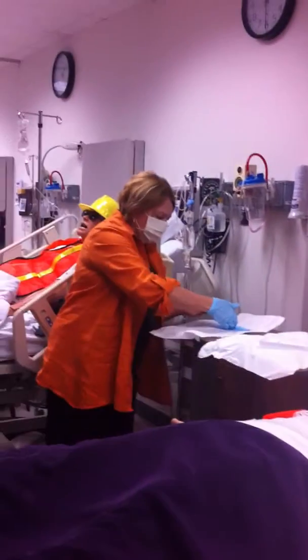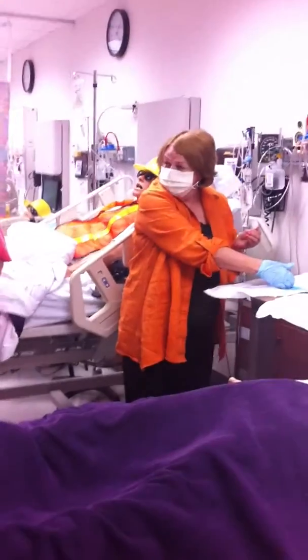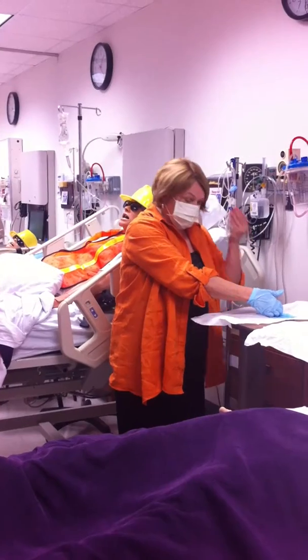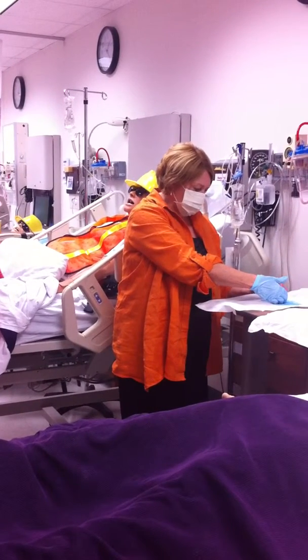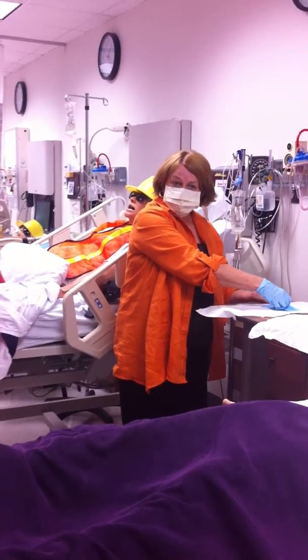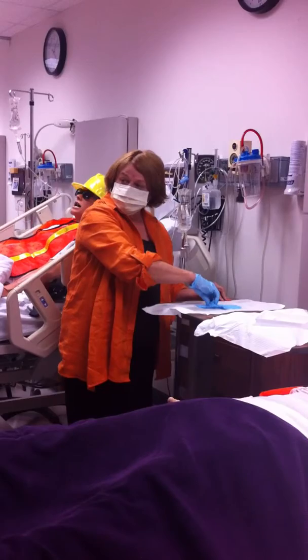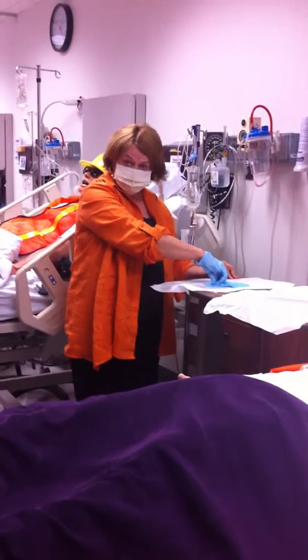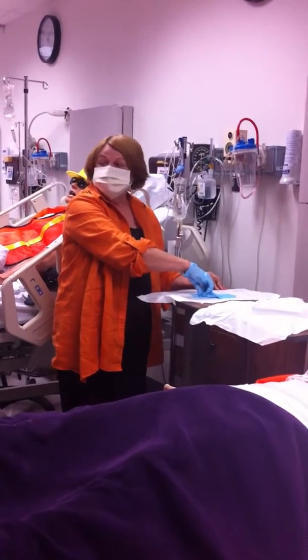Alright, now this one always is hard to get your fingers underneath that cuff like you're supposed to do. Remember, I can touch 1 inch with my ungloved hand, and I can move this any way I want to as long as I keep it out of that 1 inch perimeter, because I've got sterile touching sterile. Sterile touching sterile is sterile.